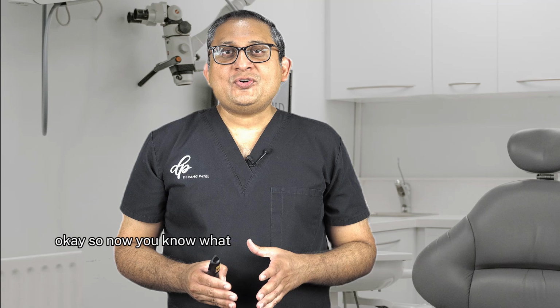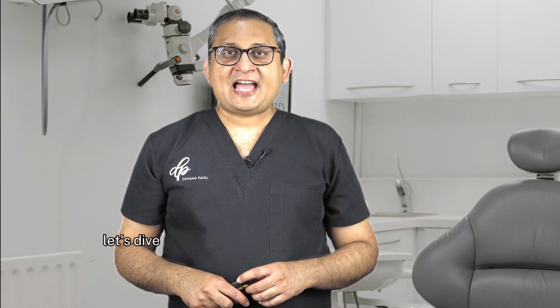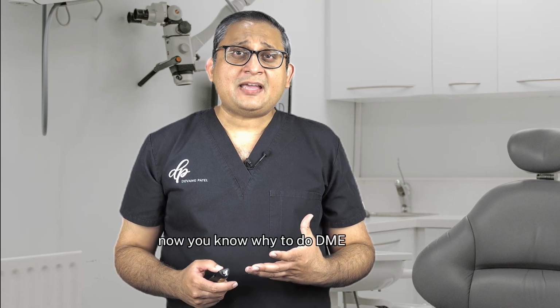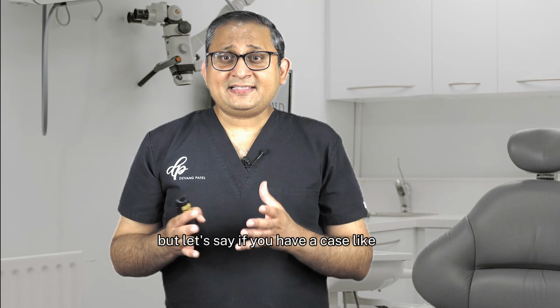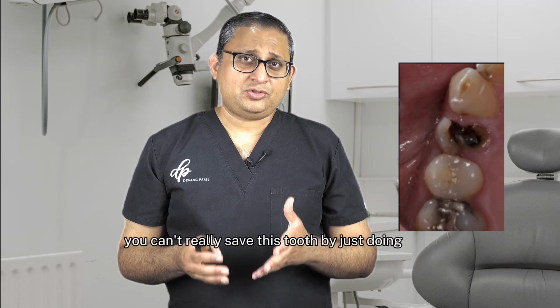Okay, so now you know what DME is and why you would want to do DME. Let's dive into tip number 1, which is knowing when to do DME. Now, you know why to do DME and why it's really important for you to learn that skill. But let's say you have a case like this where the premolar is quite badly broken down, you can't really save this tooth by just doing DME.